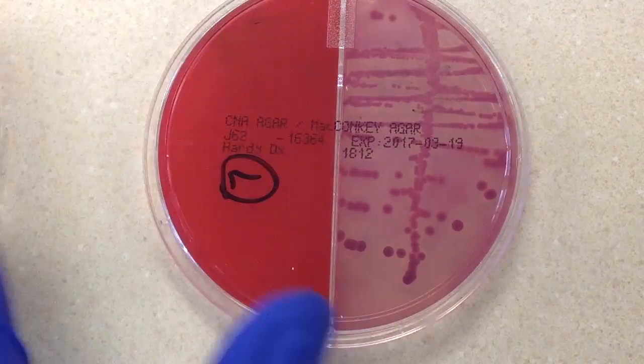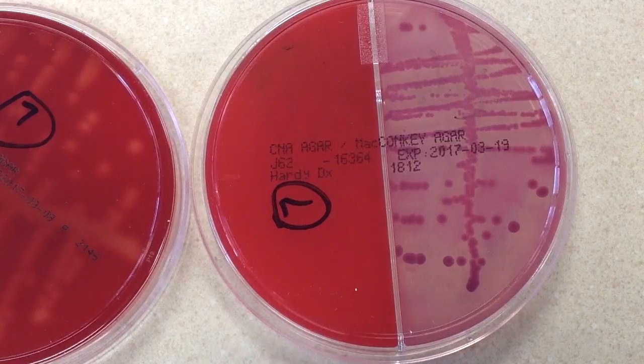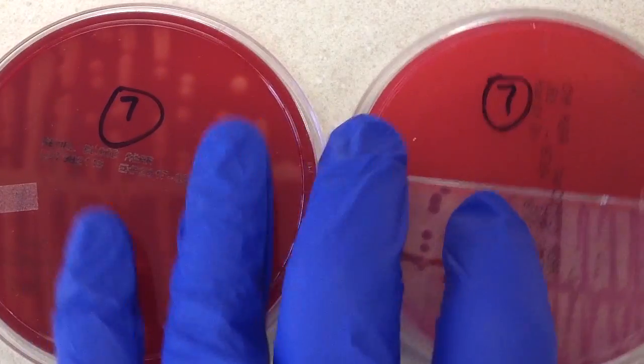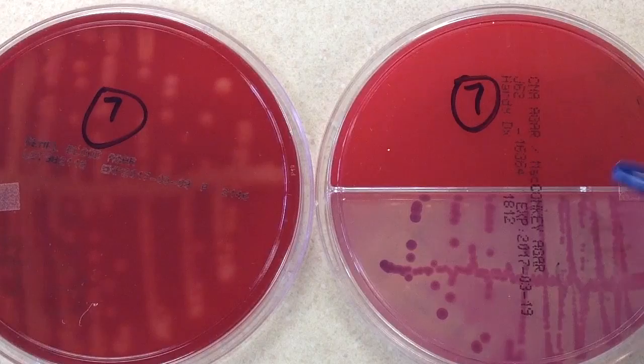This may be one of those times where we look at the specimen type. If it's a catheterized specimen, I'm pretty sure that I would work it up. But if it's just a clean catch specimen, I might not. So just for the sake of variety and that we're not working up every culture, let's go ahead and we're going to send this out as the final report.